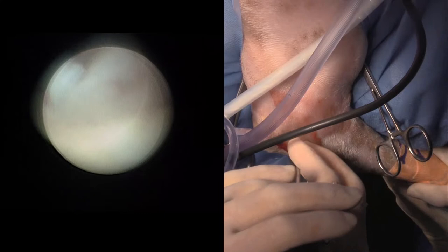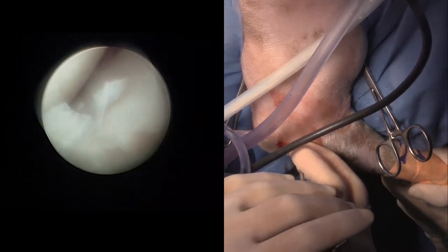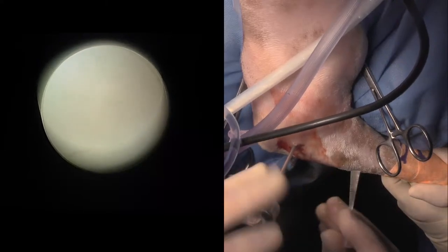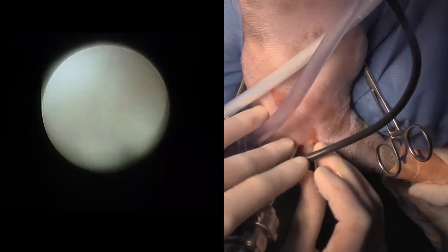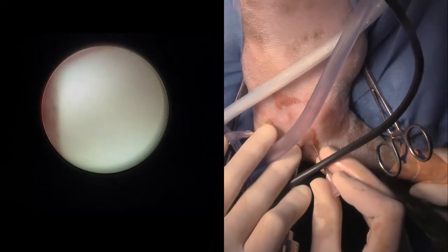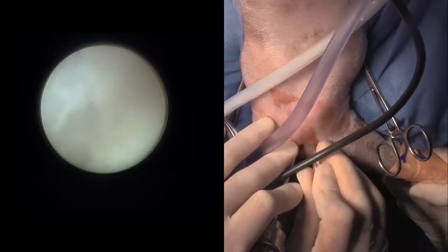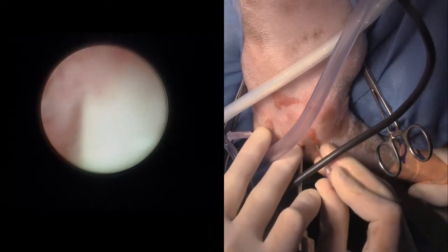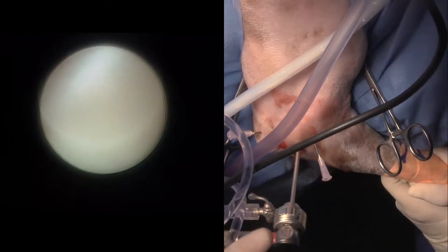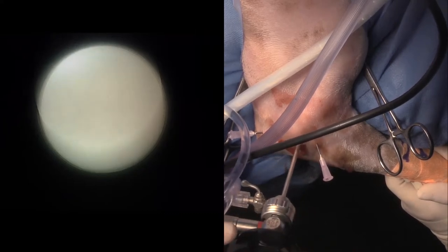Really frustrating when you get these scopes out and they're broken, because they're very expensive. So that's all fragment right there. I'll just come in with my needle alongside. And these scopes are bloody expensive. Trying to find my needle inside the joint. You can see things moving around. Can we get a towel underneath here, please? This is a 30 degree scope, 2.3 mil.